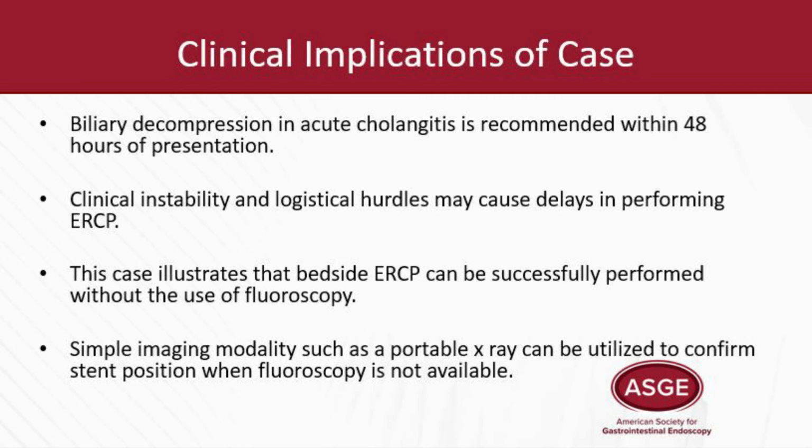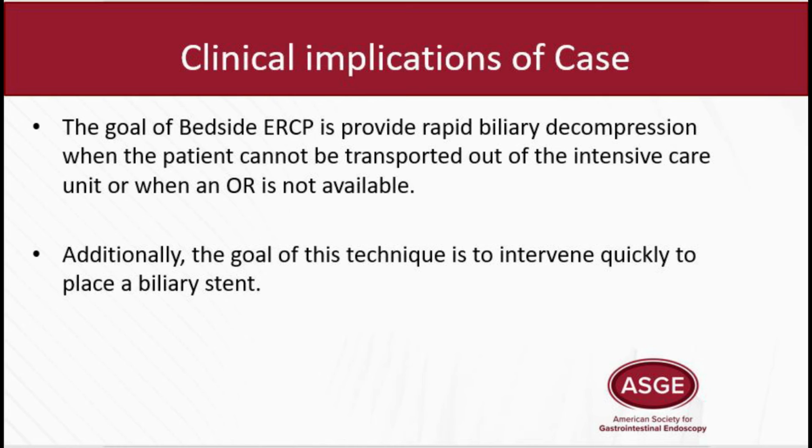Simple imaging modality such as portable X-ray can be utilized to confirm the stent position when fluoroscopy is not available. The goal of bedside ERCP is to provide rapid biliary decompression when the patient cannot be transported out of the intensive care unit or when an OR is not available. Additionally, the goal of this technique is to intervene quickly to place a biliary stent.